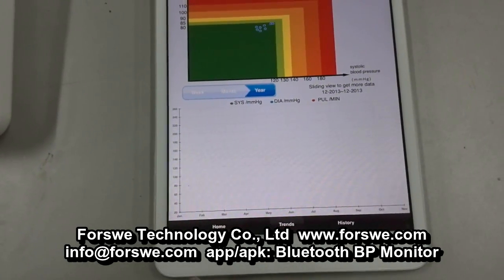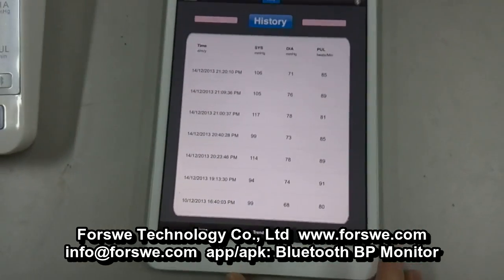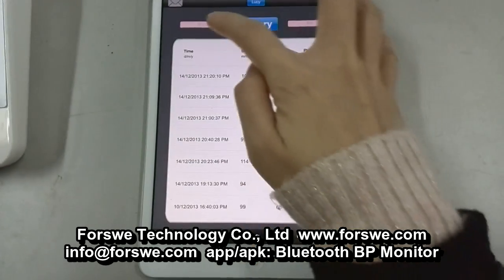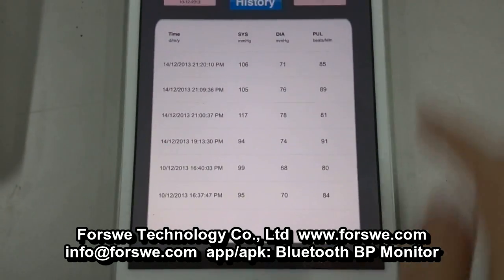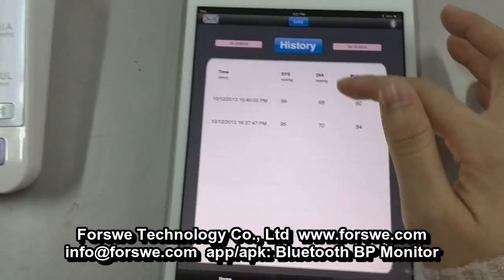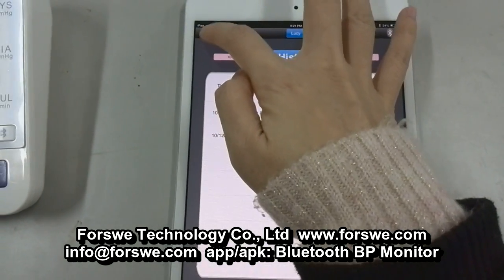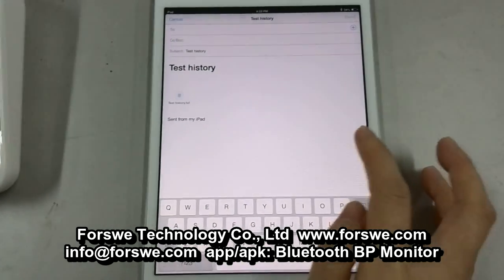All the records will be saved in the History page. In this page, you can select the records by revising the starting day and choosing the ending day. Then you will see the selected records. You can send them to your family or your doctors by sending an email — just input the email address and then send.